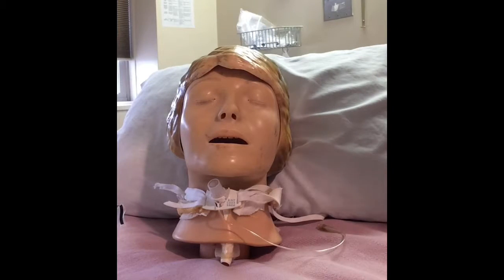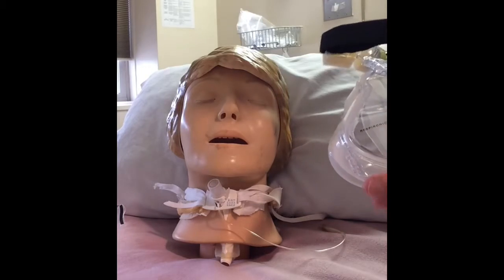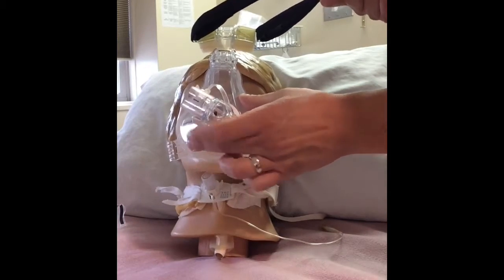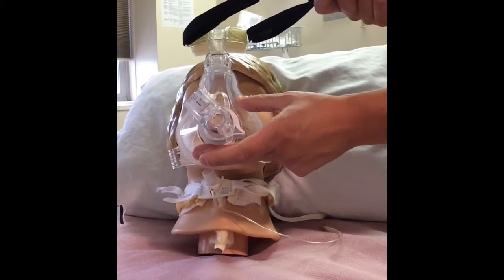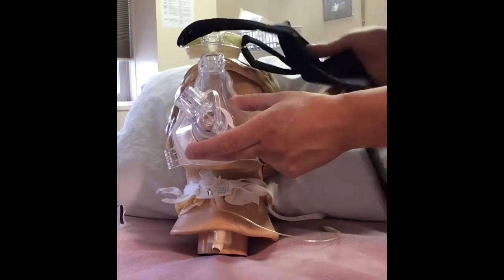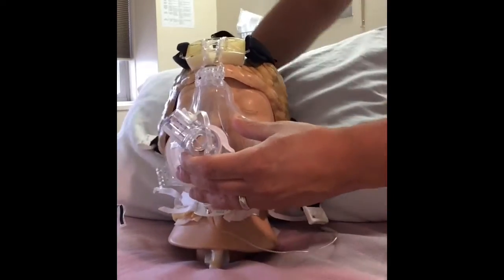So when I first apply the mask, I don't tighten it right away. I let that patient get comfortable with the mask. So I'll set it on their face and I'll hold it there in place, and I'll tell them to take a couple slow deep breaths. Try to get acclimated to the mask before you put it on. Once they're comfortable with it, go ahead and slide that on.